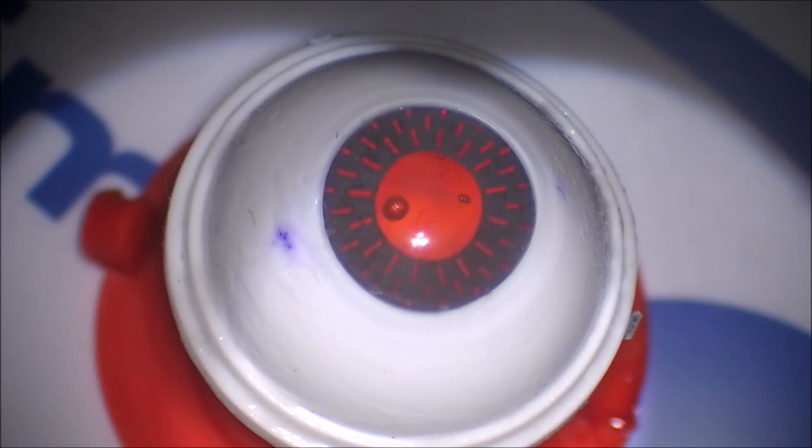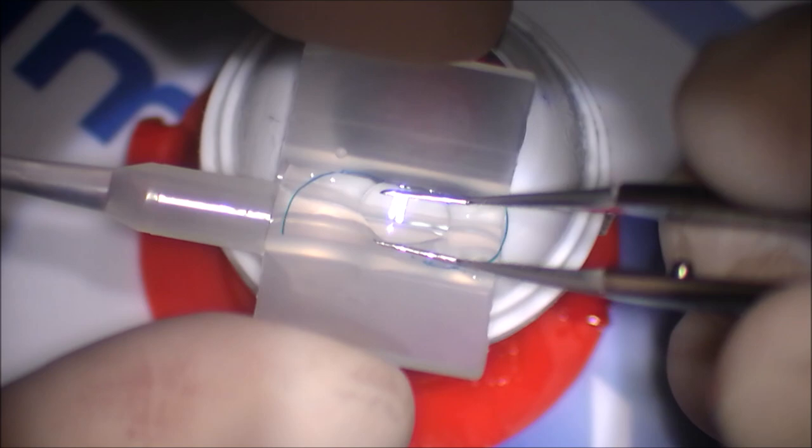So here is my Model Eye. This is a Simuli Model Eye, and this is a Sensar IOL. I'm taking it out of the case. And here's a cartridge. I put some viscoelastic and some BSS in it. And you want to seat it into the cartridge, pushing it down, making sure that the optic and the haptic are in.